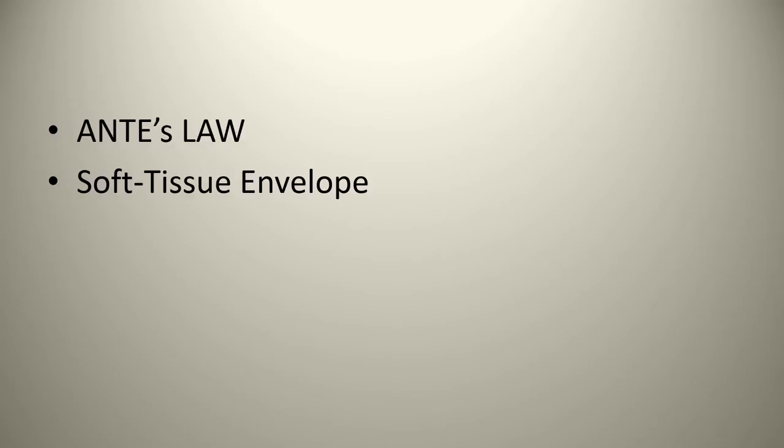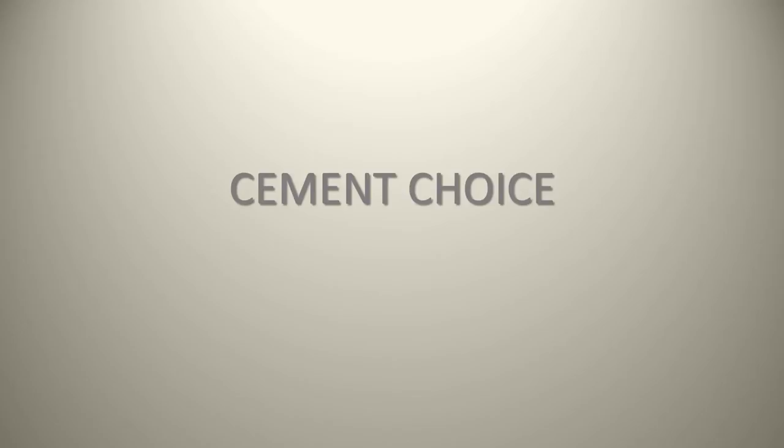We're going to next talk about cement choices. So I already told you my bias. My bias is towards not having cemented crowns, but as we've indicated, many times you have no choice. So in terms of cement, many times people talk about using temporary cement in order to have retrievability of these crowns. We use all different types of cements for patients. Sometimes we'll use Tempbond, sometimes we'll use Dycal, which is a calcium hydroxide based, basically a liner as compared to a cement, but you can use this as a temp cement as well.